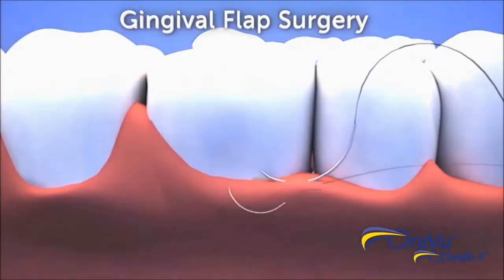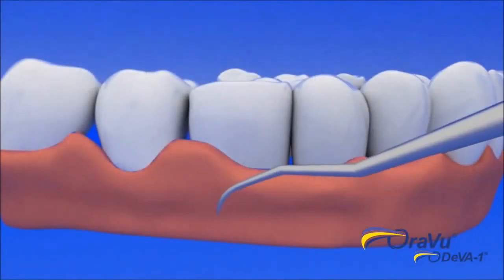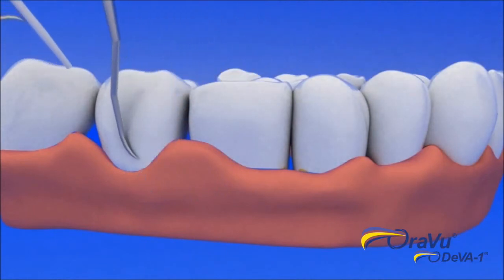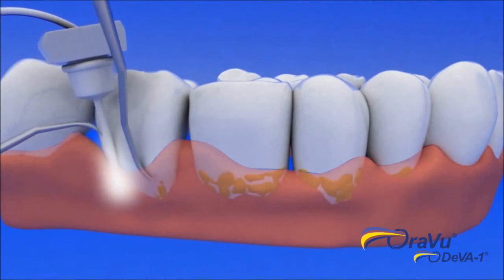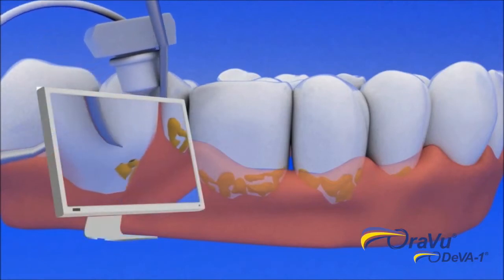Visual scaling and root planing using a 1 millimeter endoscope allows the dental clinician to see the bottom of the gum pocket and see the plaque and calculus that is in the pocket. The clinician can then completely remove the plaque and calculus because they can see a real-time video image magnified 100 times actual size.